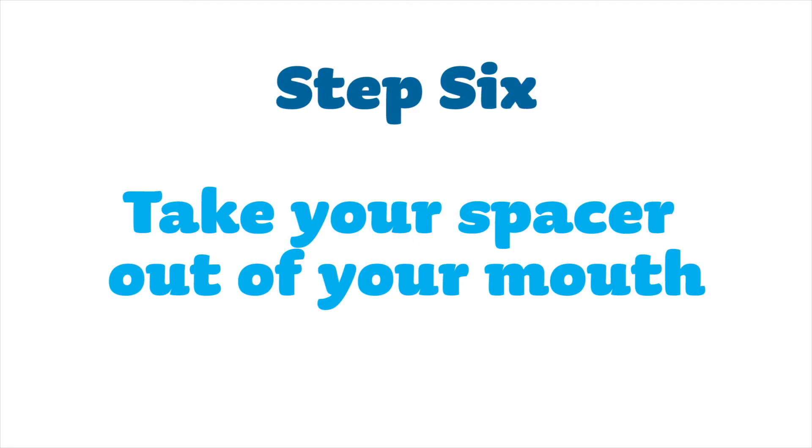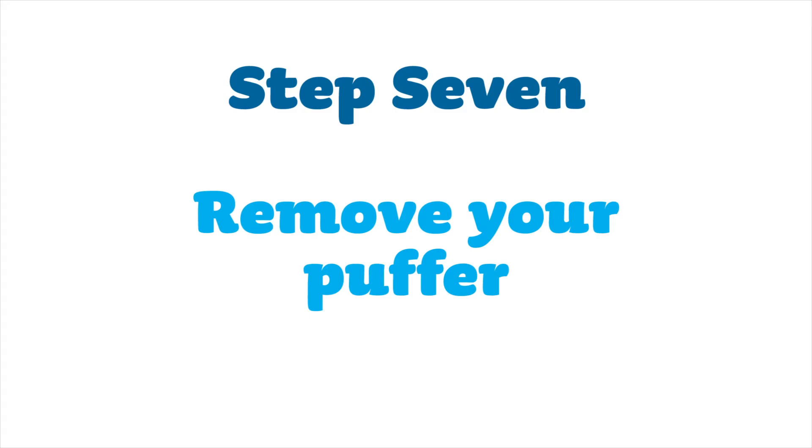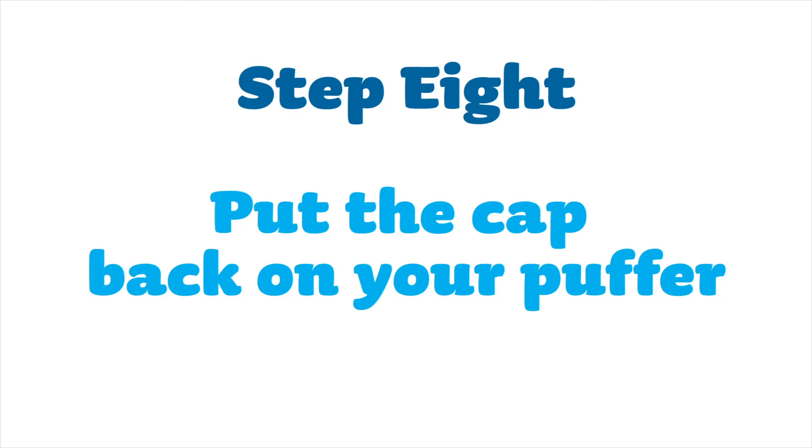Take your spacer out of your mouth. Remove your puffer. Put the cap back on your puffer.